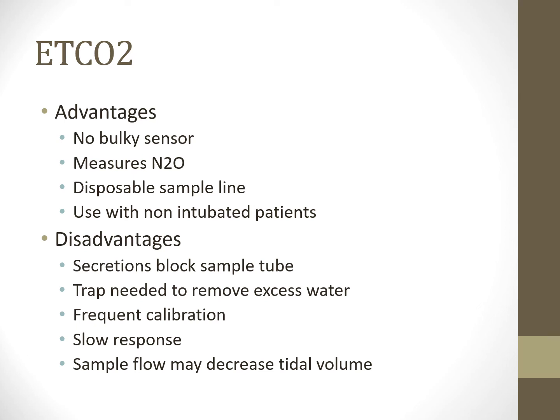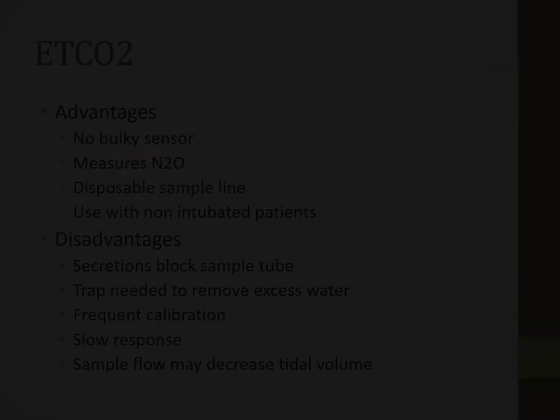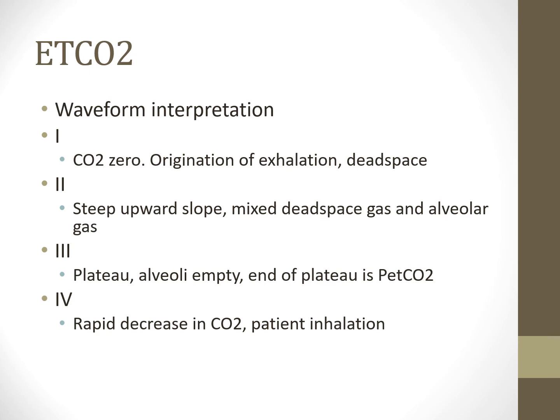And then, of course, more in your pediatric neonate population, that sample flow may decrease tidal volume and hypoventilate the patient. Interpretation, here's sections 1 through 4. Section 1 is where there's no CO2, so the CO2 is at 0. The origination of exhalation, so this is the dead space that's in your trachea and main stem, right? So there's none.